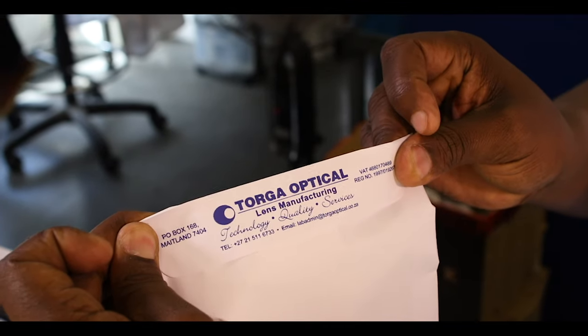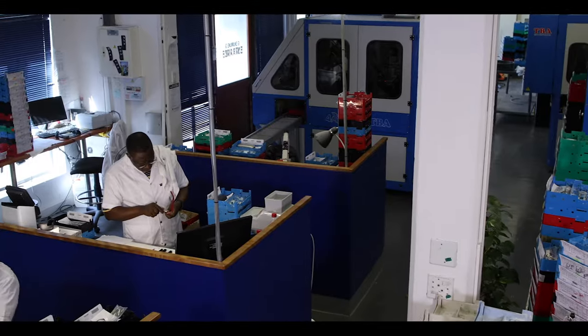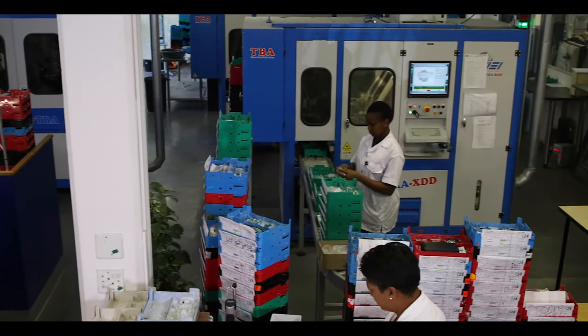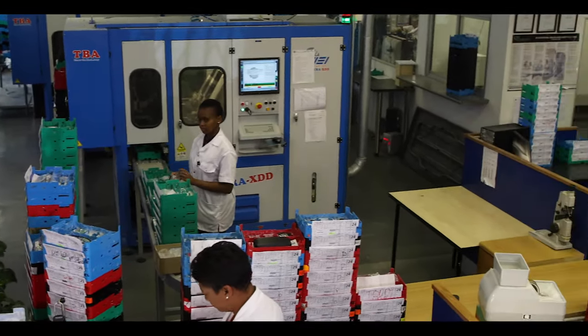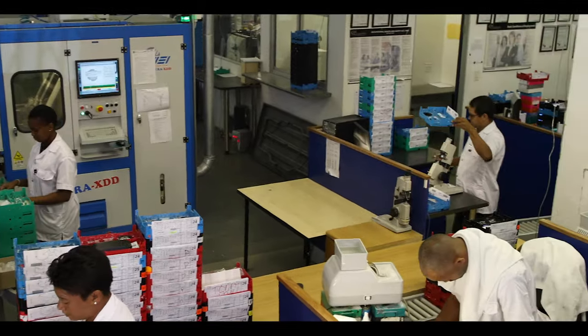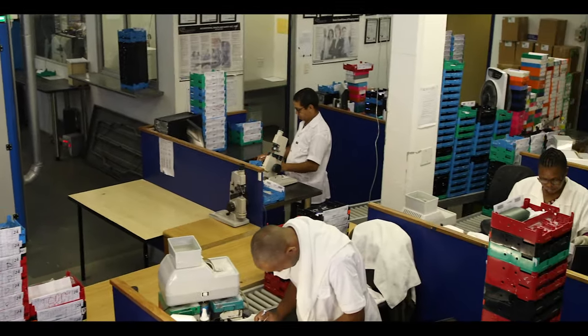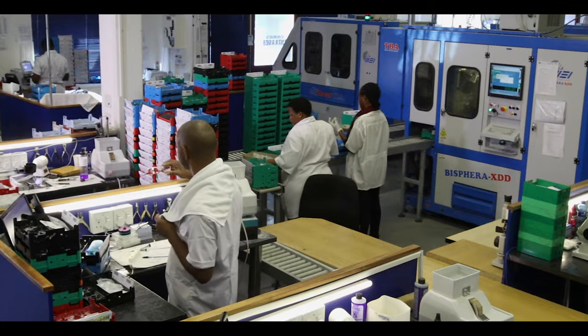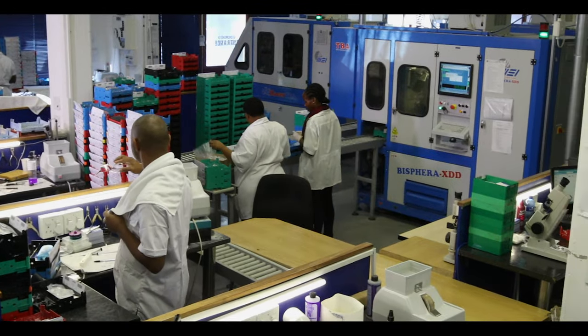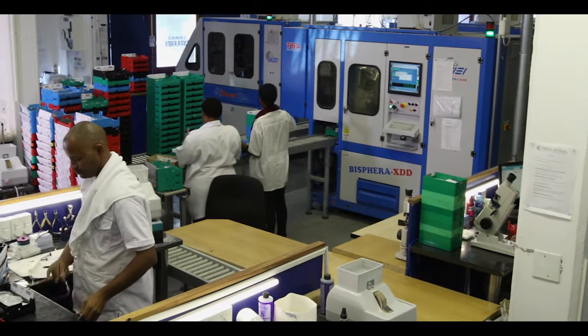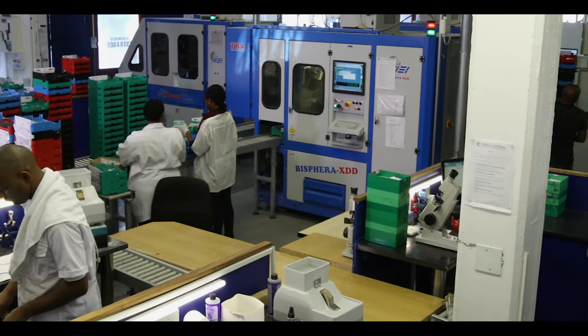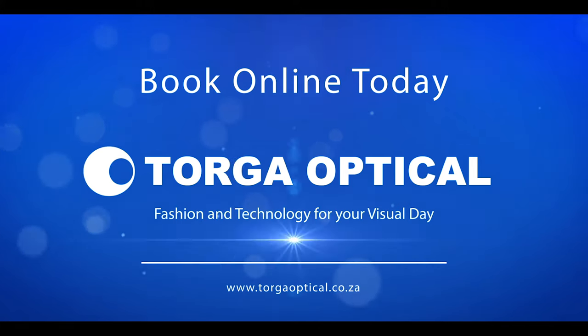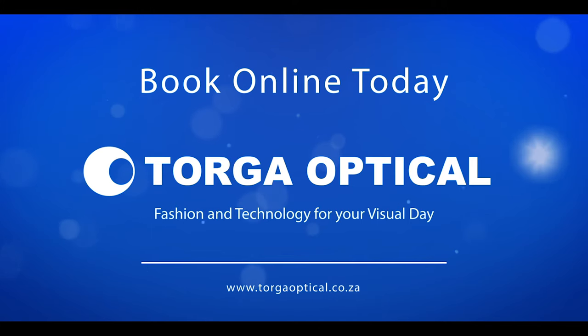This system of multiple inspections and the blend of skilled craftsmanship and computer-controlled lens manufacturing make it possible to get the finest quality eyewear in only a couple of days. Torga Optical. Fashion and technology for your visual day.